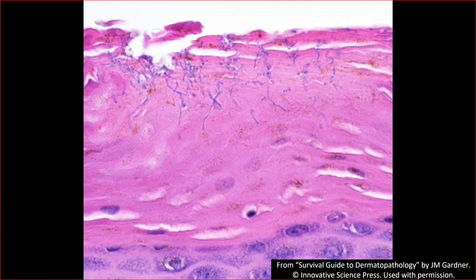Here's a closer look — that's what you're looking for. See the little blue wispy guys here. This is a 60X high dry view, not as high as oil, but higher than normal high power on a microscope. I still have to really zoom in to get these little threads. They often cluster or run kind of vertically and are much, much smaller than fungi. You can usually see them on H&E and they have a blue tint. Although I find that sometimes doing a PAS stain — even though they don't stain with it — makes them stand out better because the background turns more pink and pale. That's a really nice example of erythrasma, and again the compact ortho is the clue.